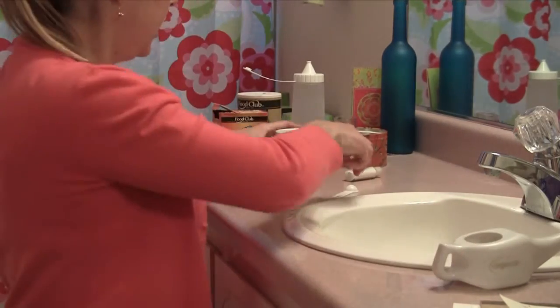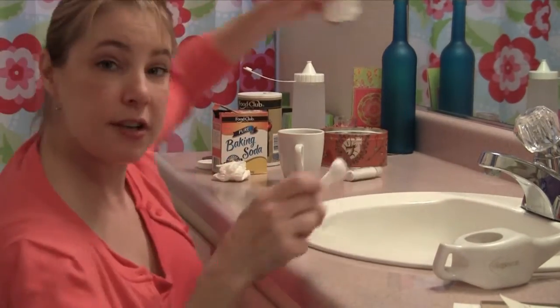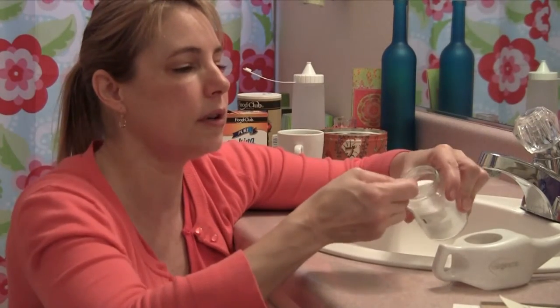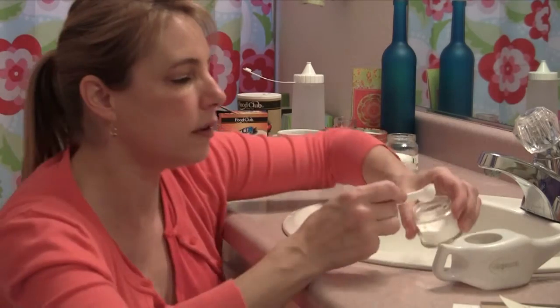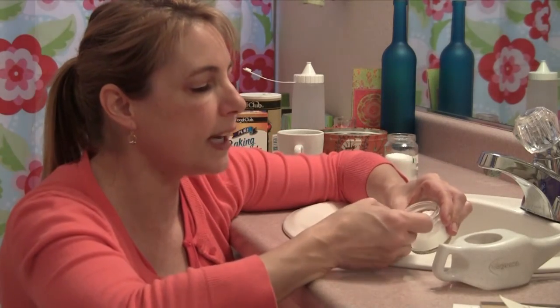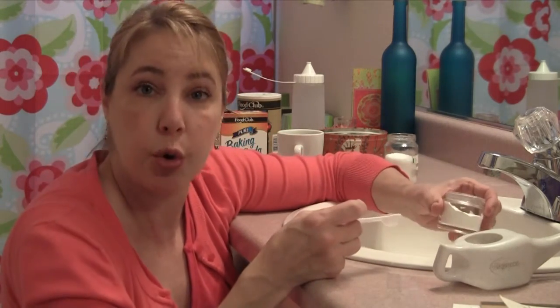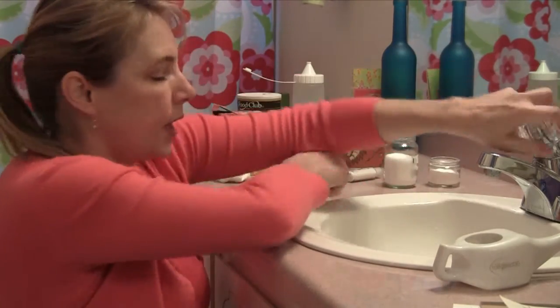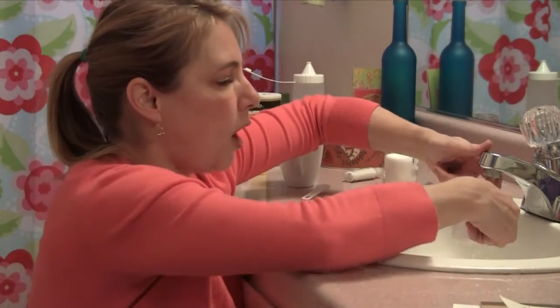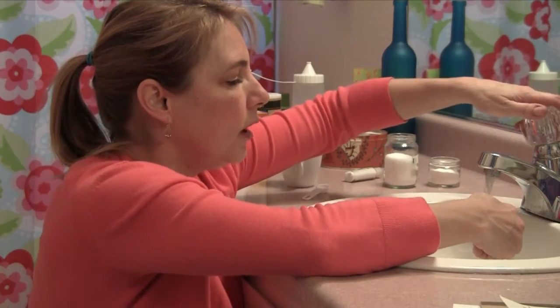Here we go, you ready? I'm going to take my salt. Here's my teaspoon. I'm gonna take my baking soda. Here's my half again as much. So I did a half teaspoon of salt and a quarter teaspoon of baking soda. Rinse that spoon off. Get the nice body temperature water, put it in there.